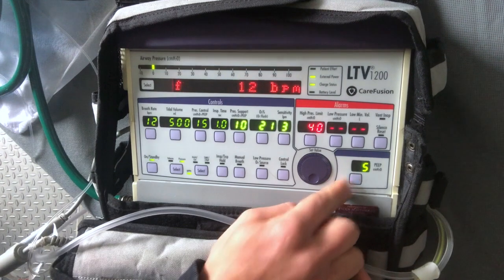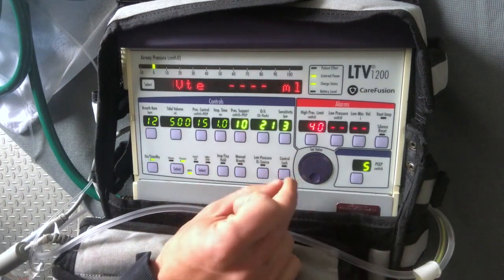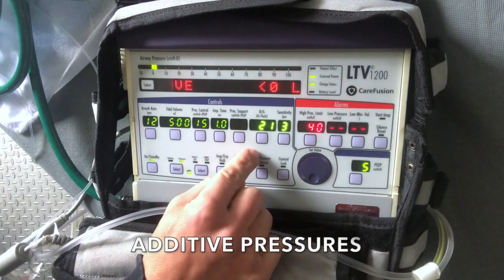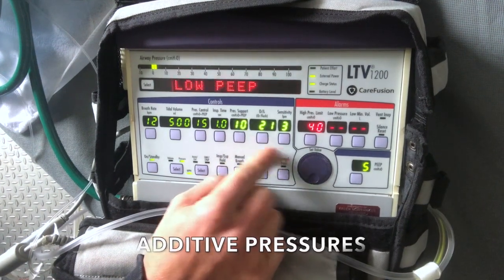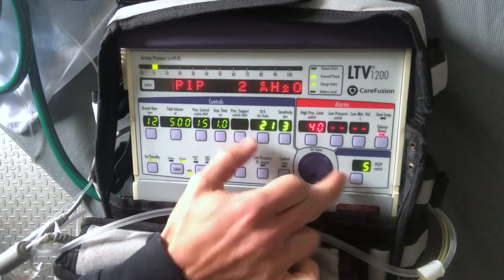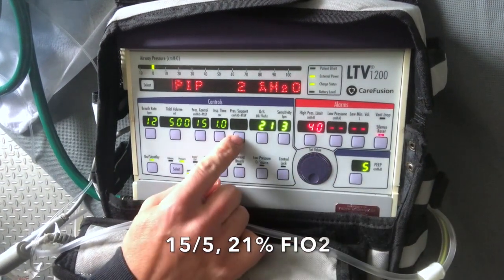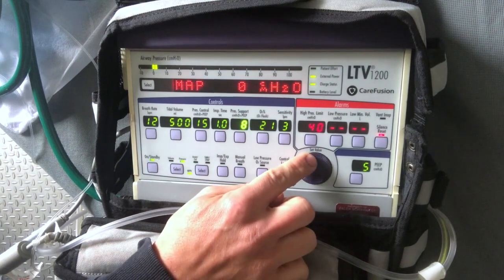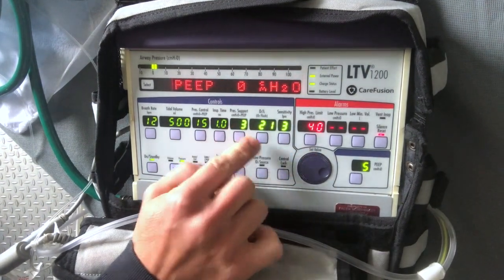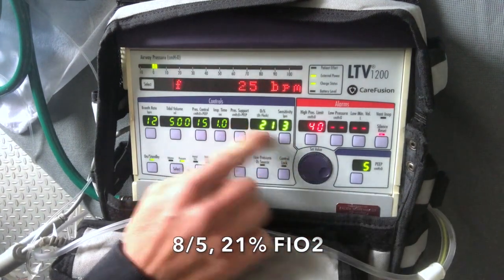Set your PEEP and confirm. Appreciate that BiPAP on the LTV1200 is additive — that means the numeral will be a combination of pressure support and PEEP. This setup gives us a setting of 15 over 5 with 21% FiO2. If you wanted a setting of 8 over 5, you'd dial your pressure support down to 3.